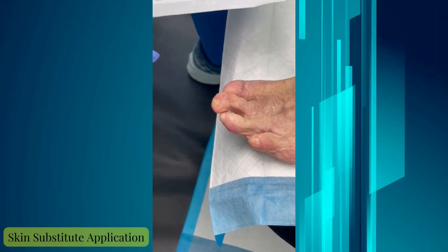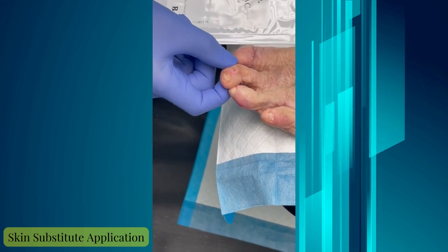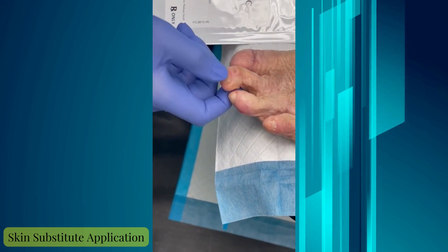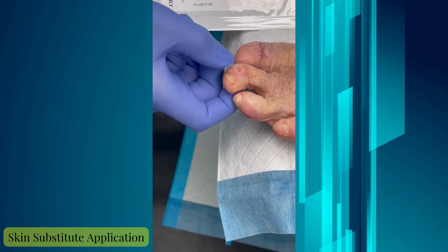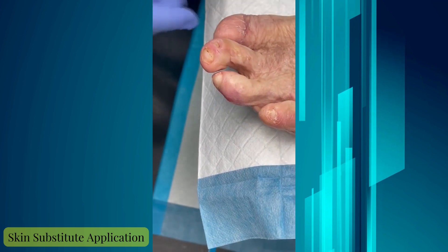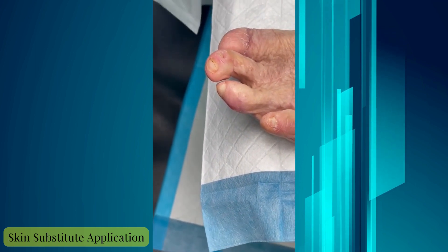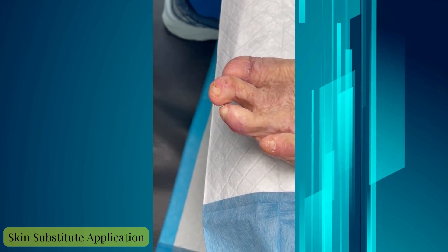We have our patient here who has an ulcer on the second toe at the DIPJ. We've cleaned up the wound and we've been using some collagens, and now we're going to transition to a skin substitute. This will help to bring the wound to closure a lot faster than standard of care.